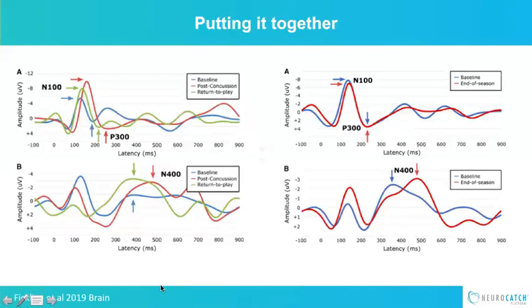All right, so let's put it all together. For the end of Module 2, I just want to take you through some clinical examples using concussion. So this is work that we did in ice hockey players for concussion testing. We'll start on the left-hand side.